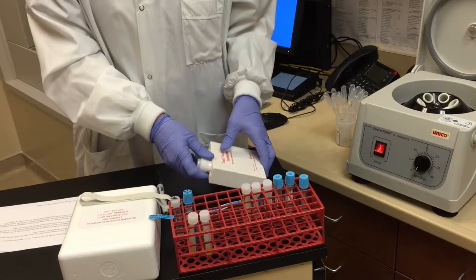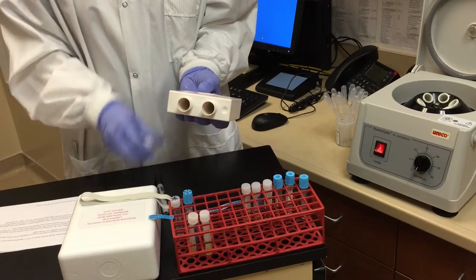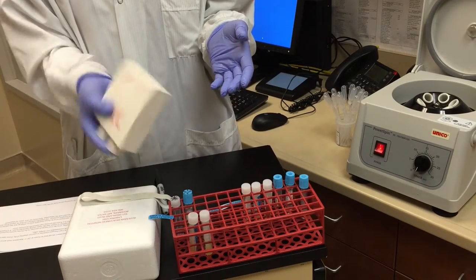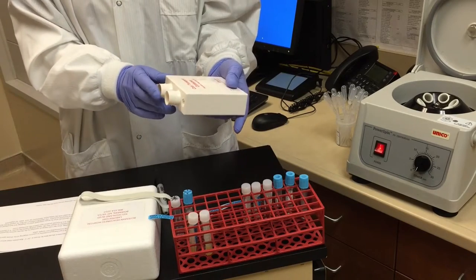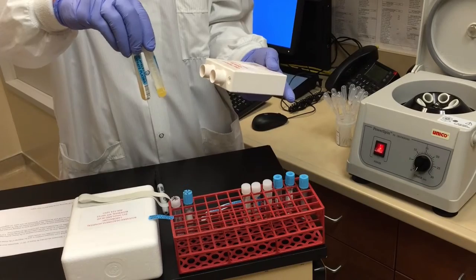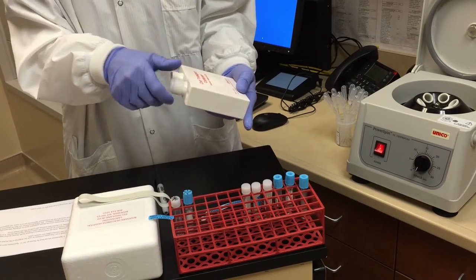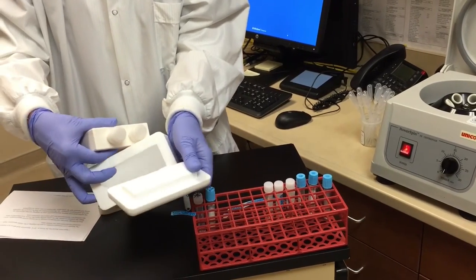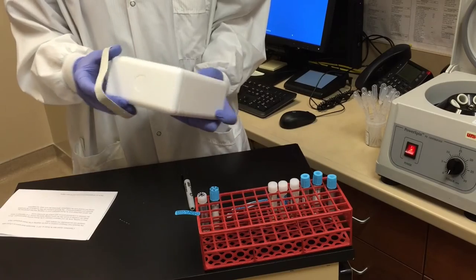We use the Sarstead cooling transport container for shipping of frozen specimens, and each container can accommodate two sample tubes. Prior to mailing, put the Sarstead container into the freezer section, shake and mix it up, then freeze it. It needs to be frozen in a horizontal position and without the styrofoam transport cover. The patient specimens must be frozen separately prior to shipping and then placed into the Sarstead cool transport container, which can then be placed in the styrofoam container and secured with the rubber band.